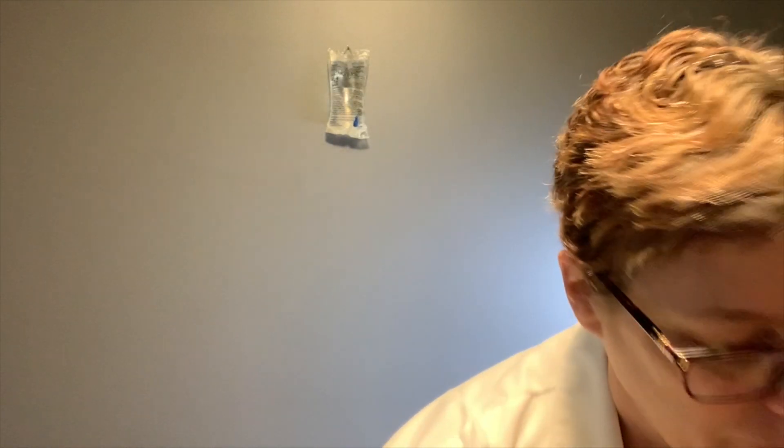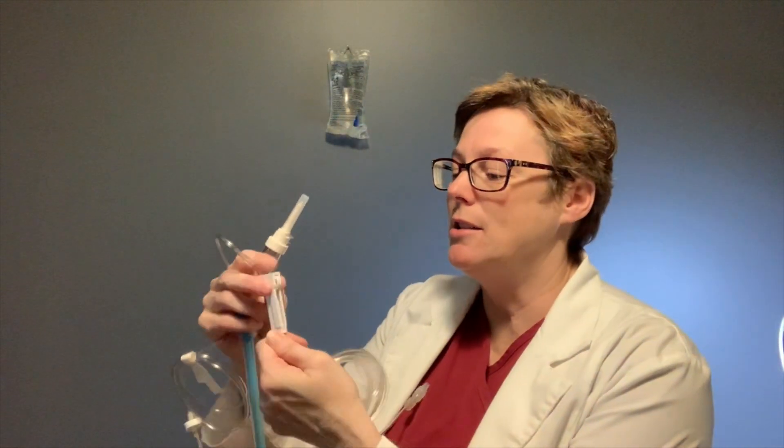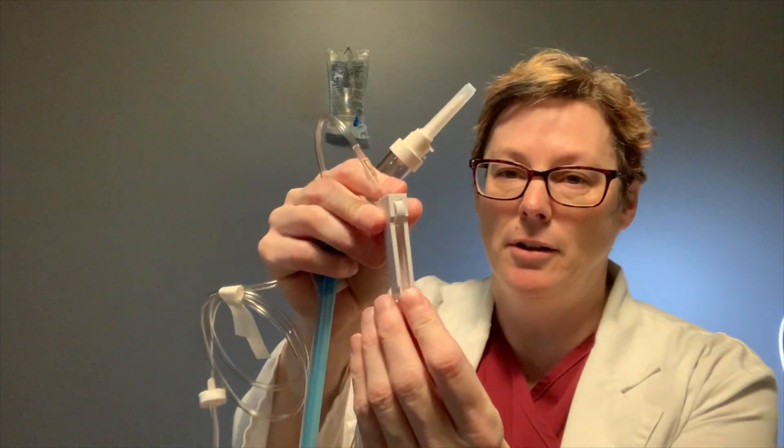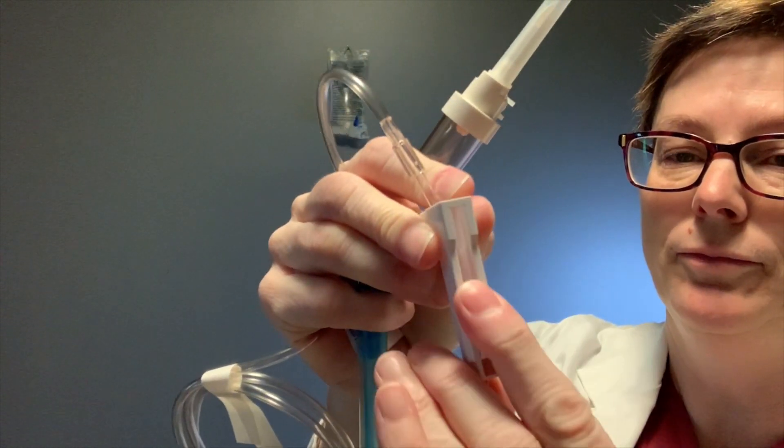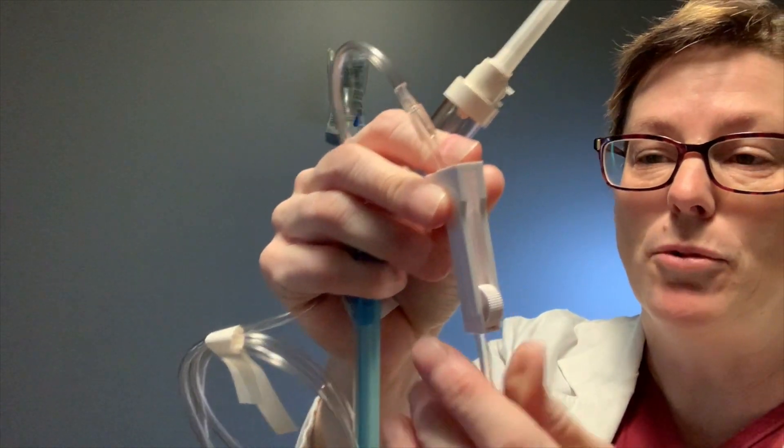I've already checked my IV fluids — the expiry date is good and it's the right fluid for my patient. Now I'm going to take my IV line and get that ready. One of the very first things you want to do is lock the roller clamp, taking it all the way down. That is the first step.